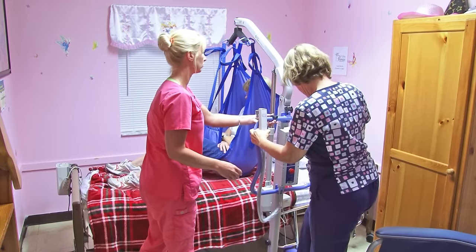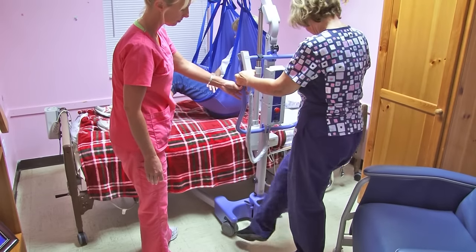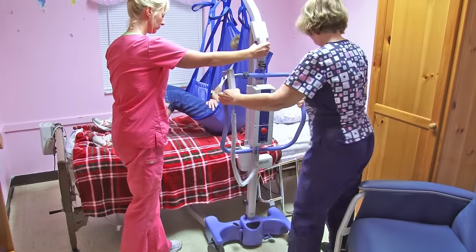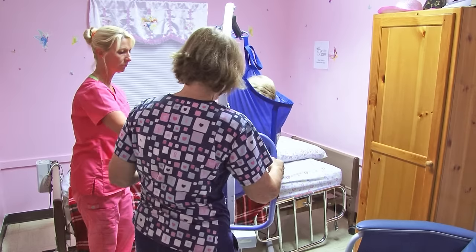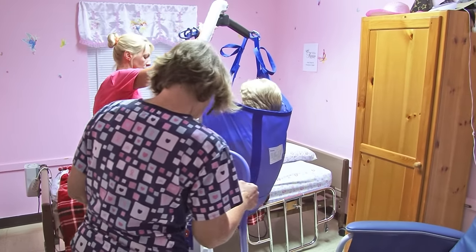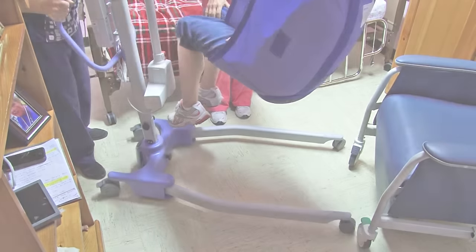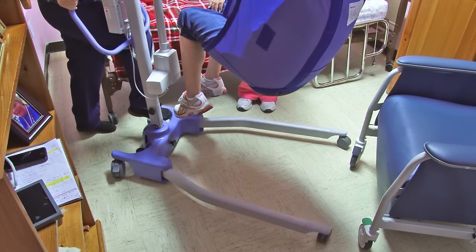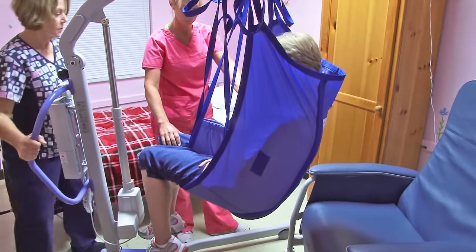Now we're going to unlock and move her over to the side. You have to come this way. I am maneuvering it. Now that we're out of the way of the bed, I'm going to open up the bar again for a better replacement for the chair. Press the gate — there we are, open now. Let me just come over a little bit this way.